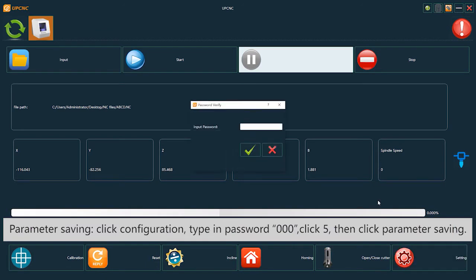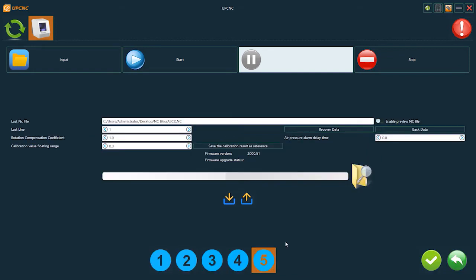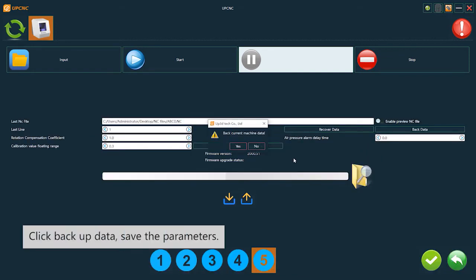Click configuration and type in password 000. Click 5, then click parameter saving. Click backup data and save the parameters.